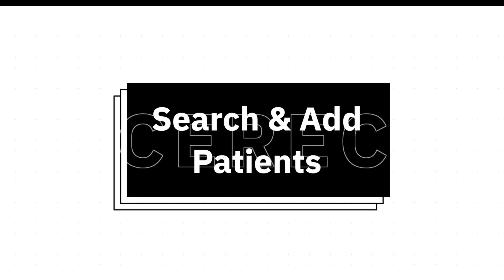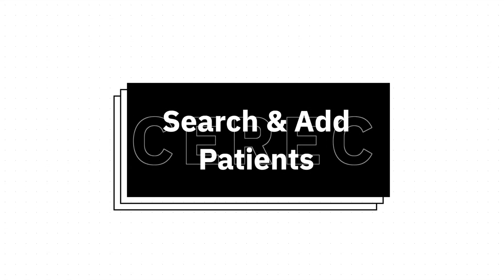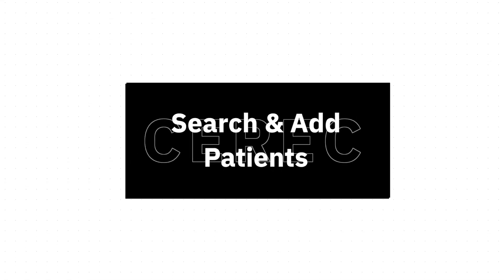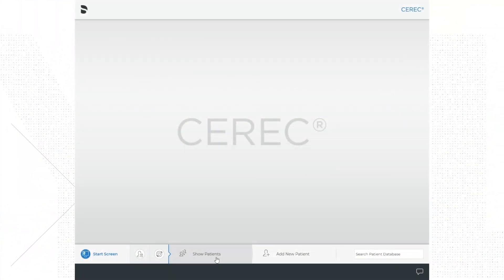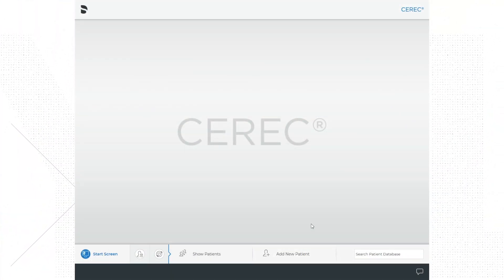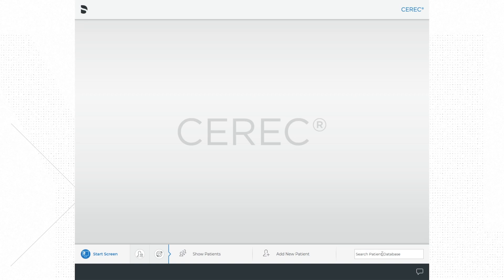At the bottom of the screen is an option to show patients or search patients and cases you've already entered into the system.